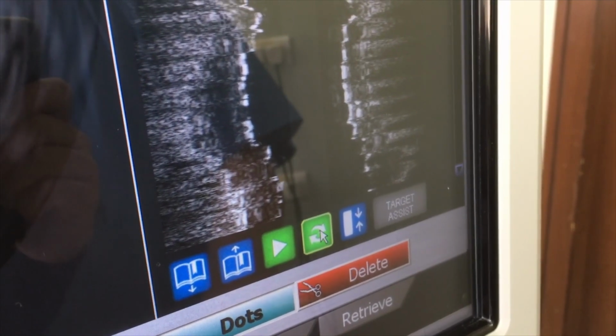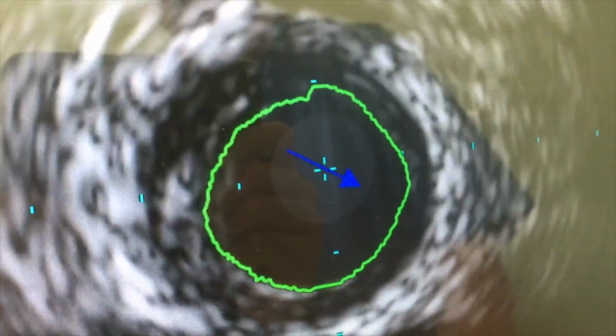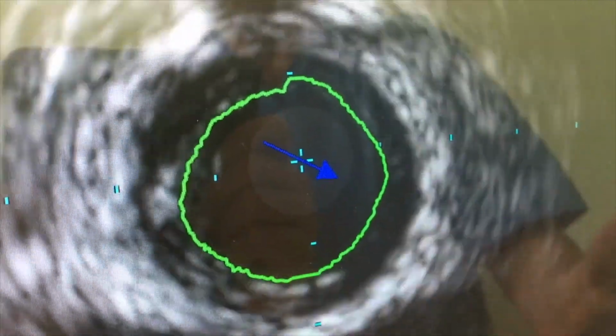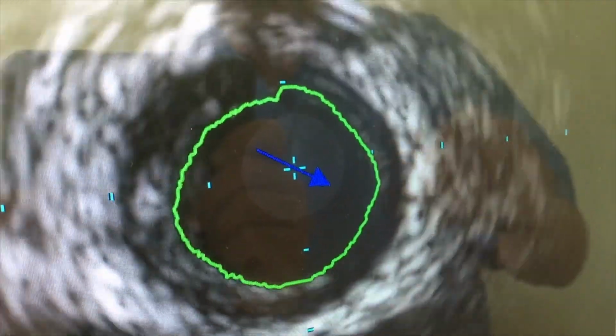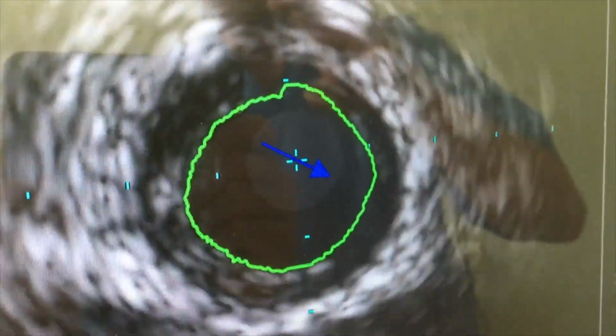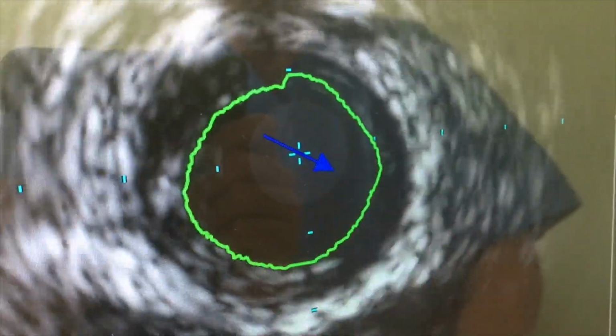What dynamic review means is the frame is going to move 3 frames back and 3 frames forward from this frame where we have done the measurement, and this will show if it's the true plaque that is moving, and you can see if you've outlined the true plaque or not.